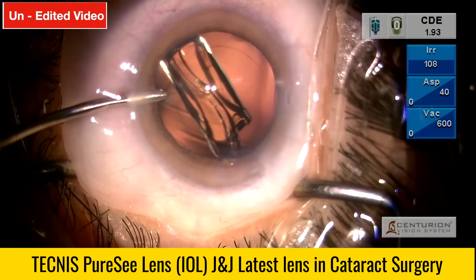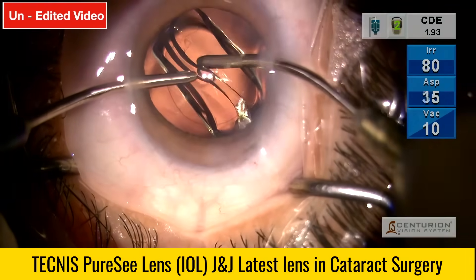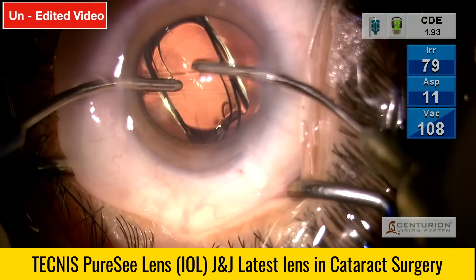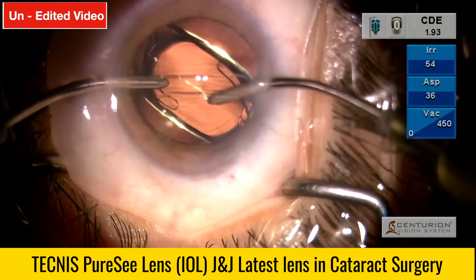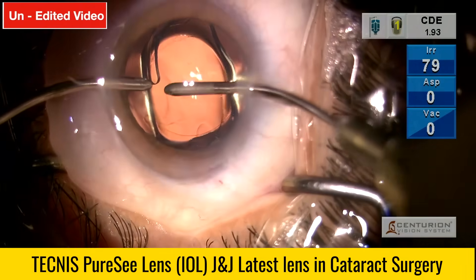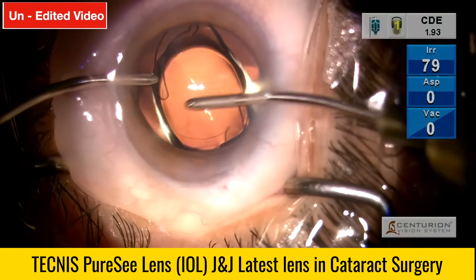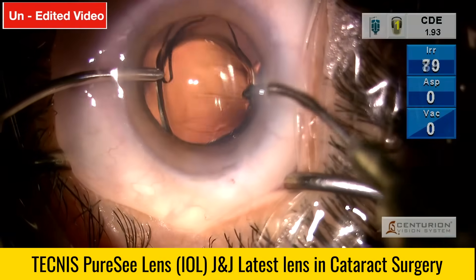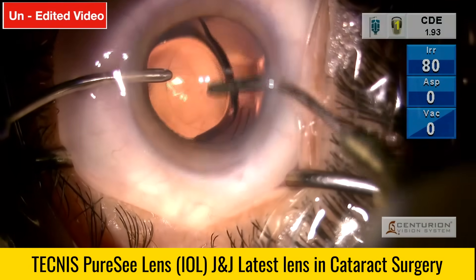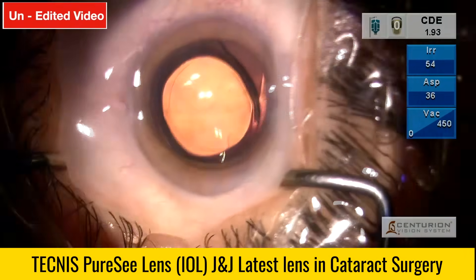We've been implanting iHance lenses regularly — the monofocal plus category from Johnson & Johnson. They go in nice and smooth, then open nice and gently, giving ample time to manipulate and set the lens in the bag before the haptics open and take position. The lens is gently opening. I set the lens in the desired position for the haptics. Because the lens was inserted under hydro, the viscoelastic cleaning is comfortable — cleaning any strands of viscoelastic under and over the lens. The lens is now nicely opened in the capsular bag.